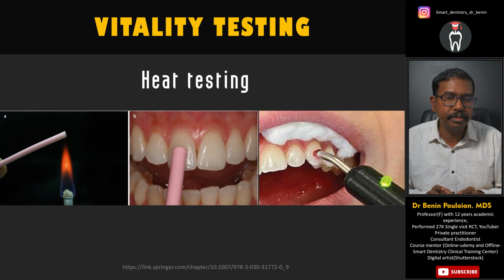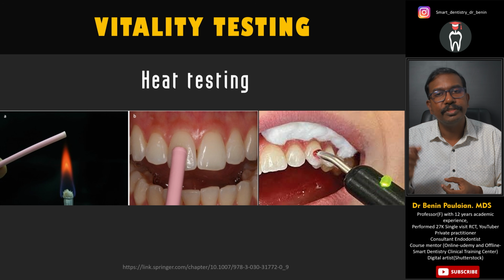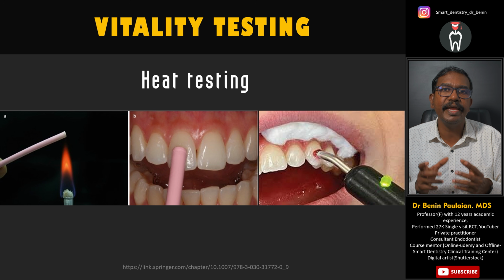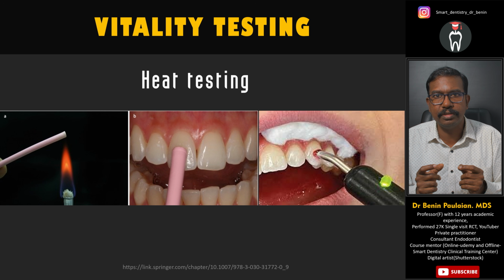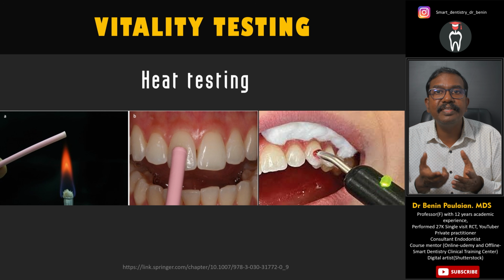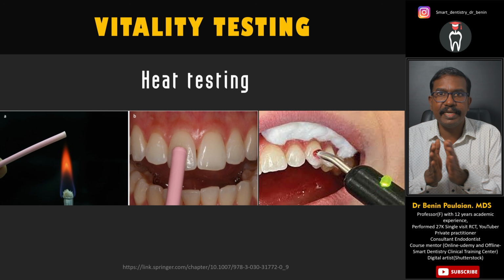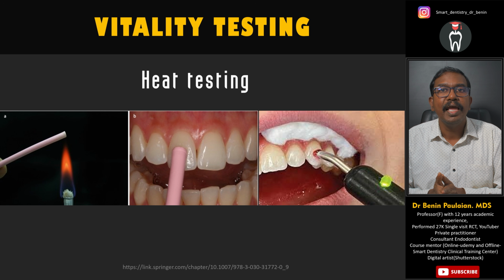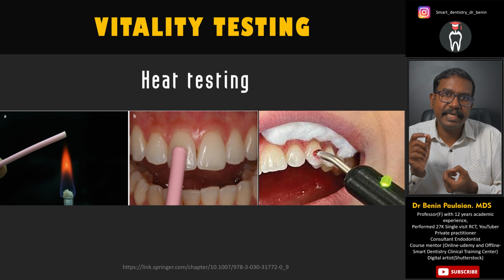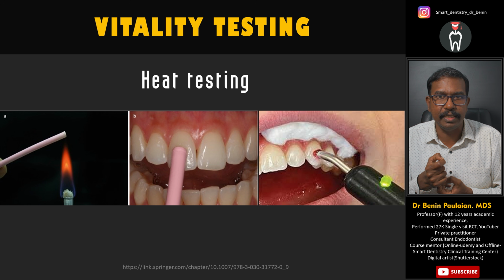What's the first step to do? We have to test it over a normal tooth, not the tooth in question at first. Once we establish a response, for example, after 3 seconds there is a response elicited by the heat, we can keep that 3 seconds as a standard or reference value, and then repeat the test in the same manner in the tooth in question.